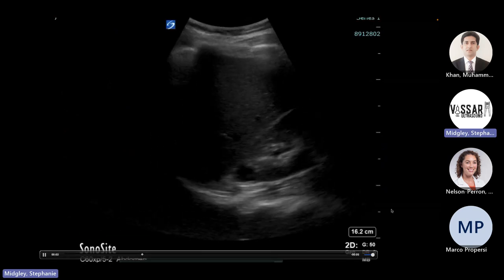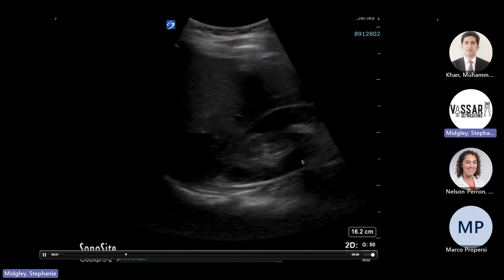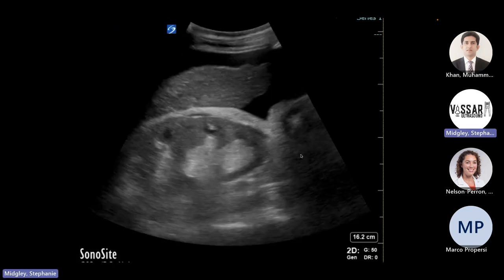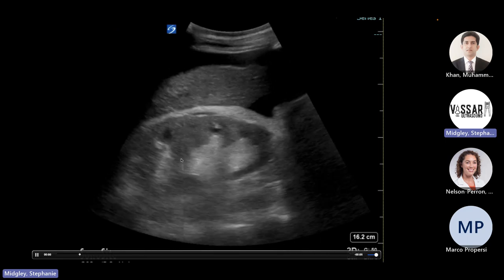And so some renal pathologies, you can see that there's something bright white in the kidney here. So this is your angiomyolipoma. This is just a benign, most common fatty tumor in the kidney. Again, this is your medullary sponge kidney, just kind of bright white filled with calcium.